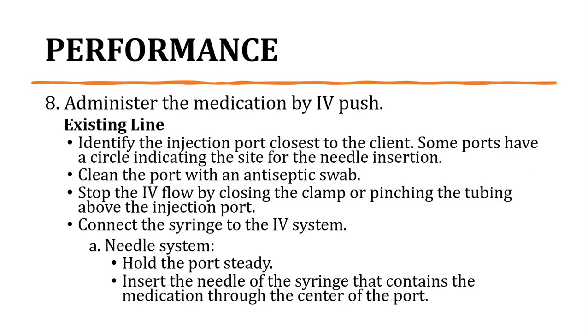Then the next variation for administration of medication by IV push is through the existing line. First is to identify the injection port closest to the client. Some ports have a circle indicating the site for the needle insertion. Kailangan po dun tayo sa injection port na close sa client para po ma-ensure na ma-administer agad-agad yung medication.